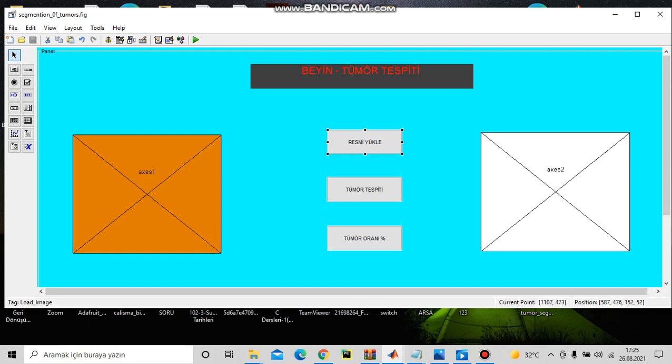And I'm going to use the second one, name is axis two, to also show the detection of the tumor in brain.